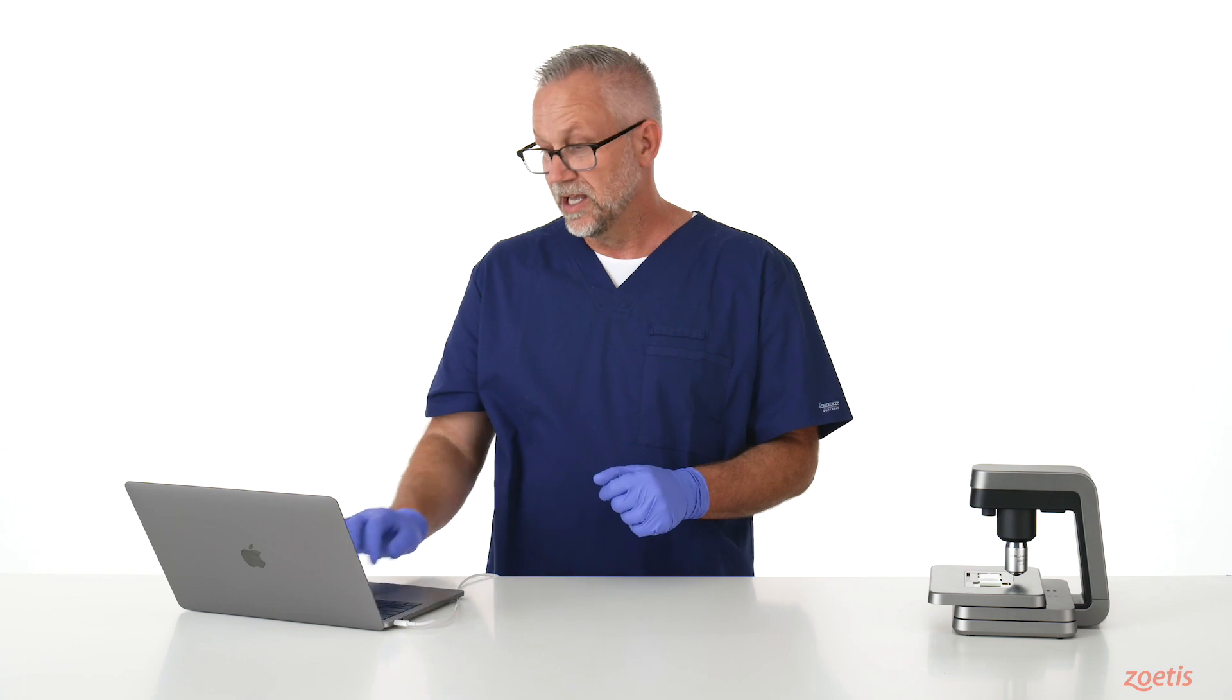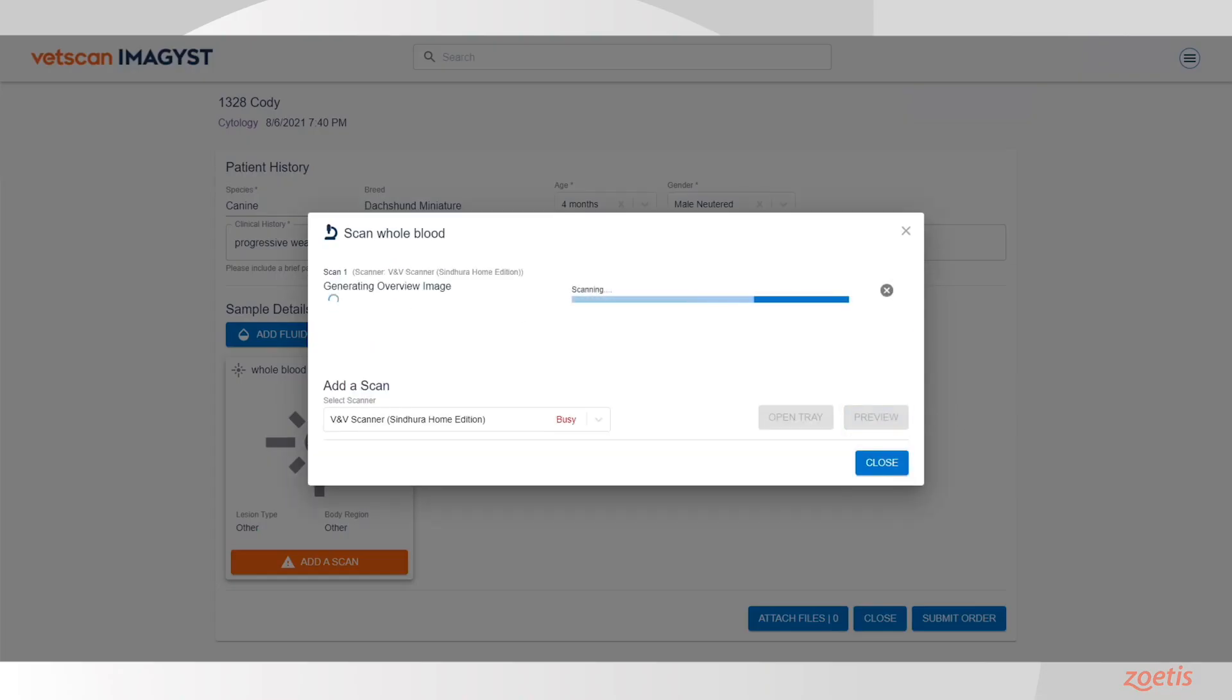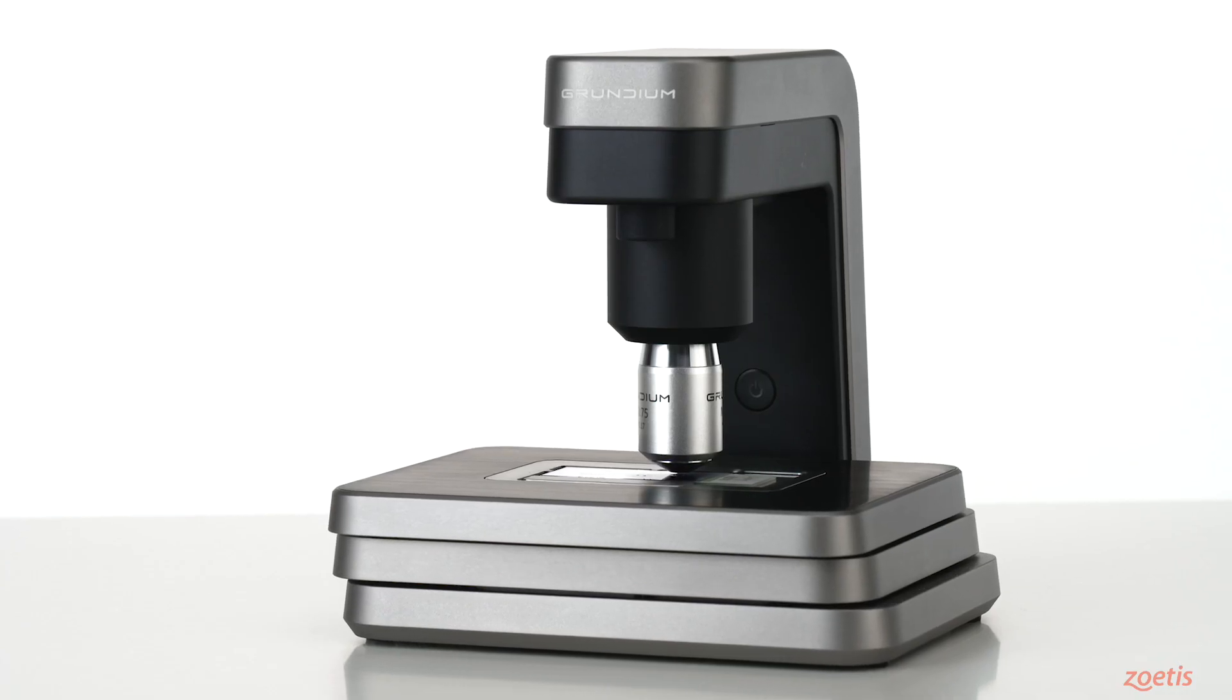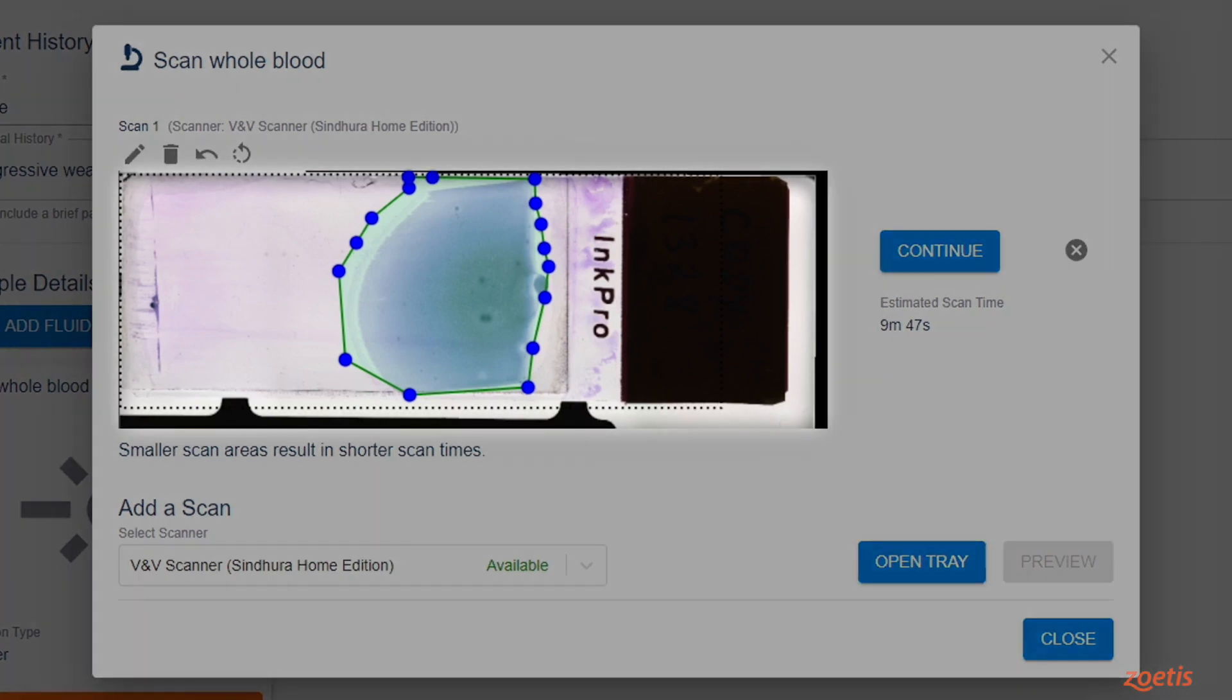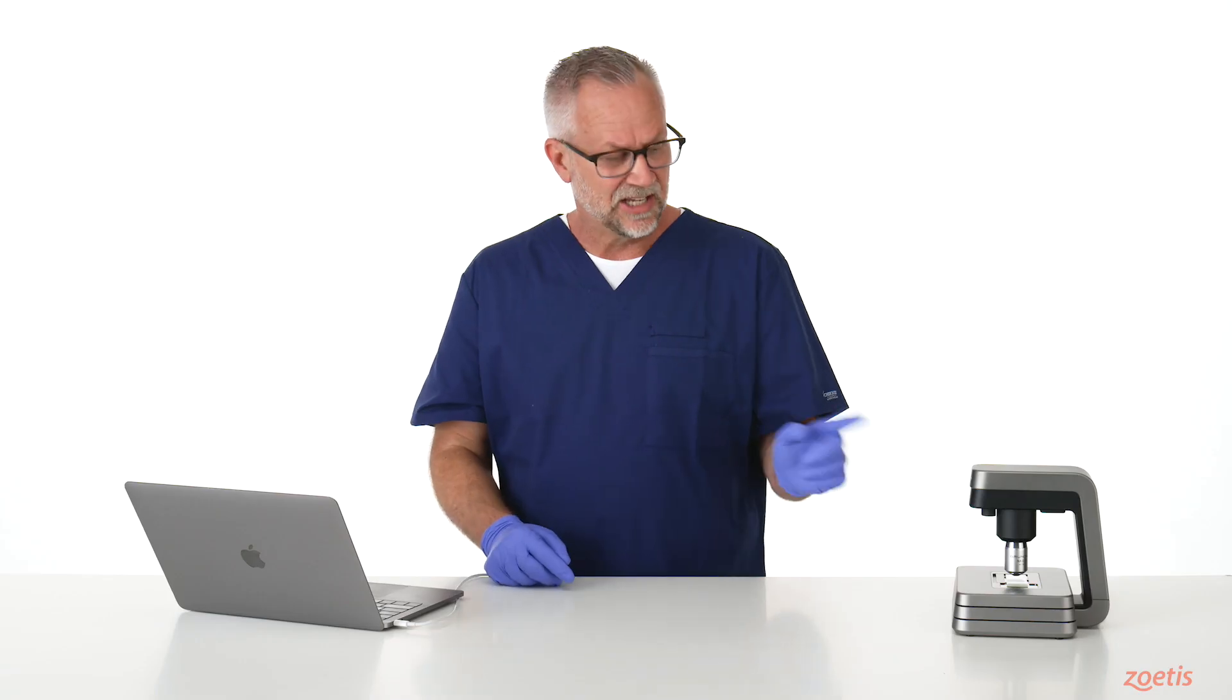Return to VetScan Images and click on the Preview button. When the Preview appears, review the suggested scan area and the estimated time to scan. If both are acceptable, click Continue, and the scanner will take it from there.